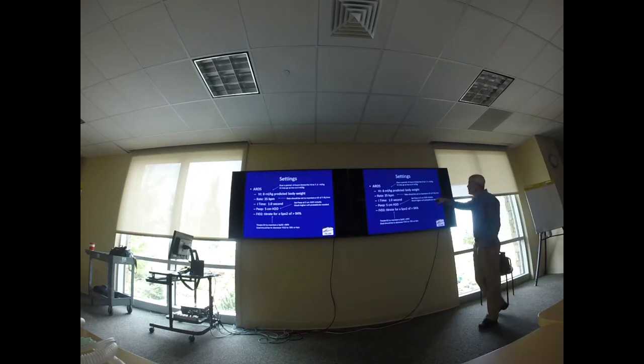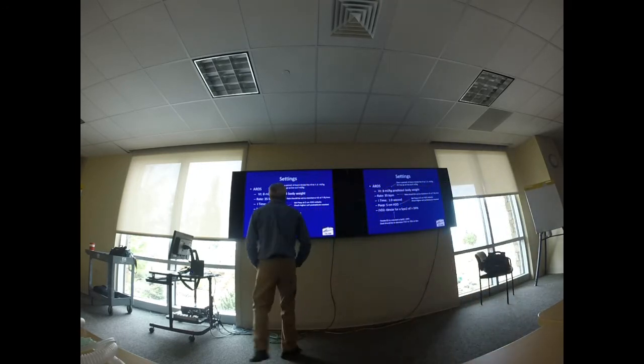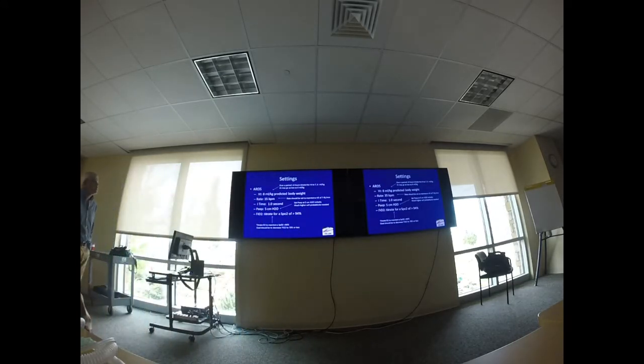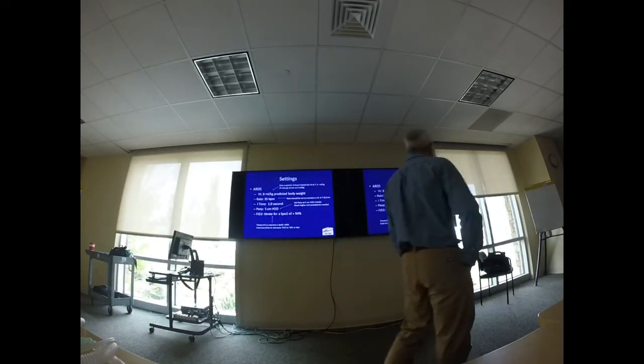So 7, 6, 4, and so on. My rate should be set to maintain a minute ventilation between 7 to 9 liters per minute. And the initial rate they start out at is 35 breaths per minute, quick, right? So I'm breathing in pretty fast. My I time is about a second.